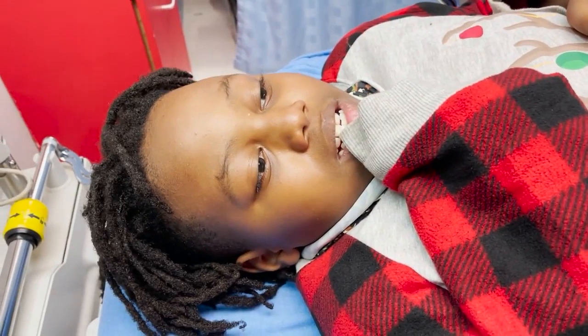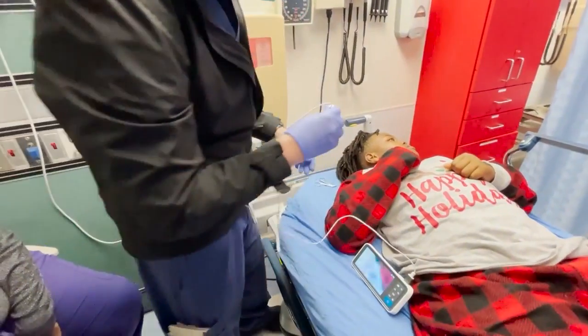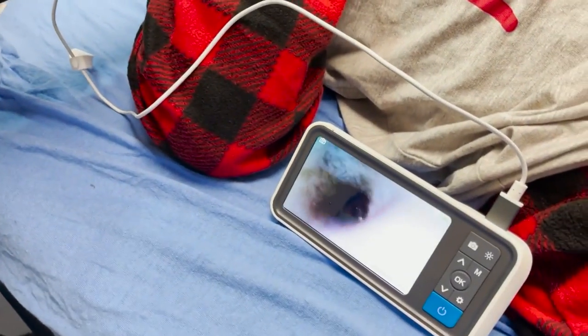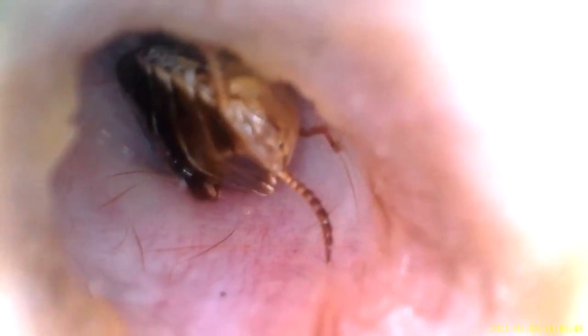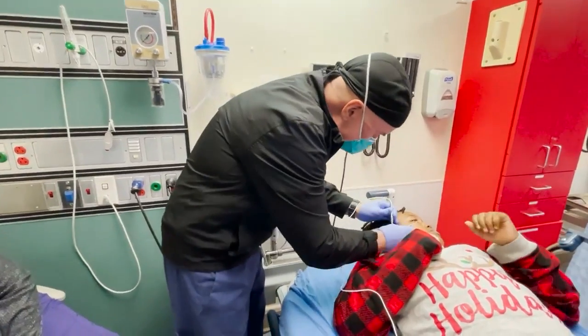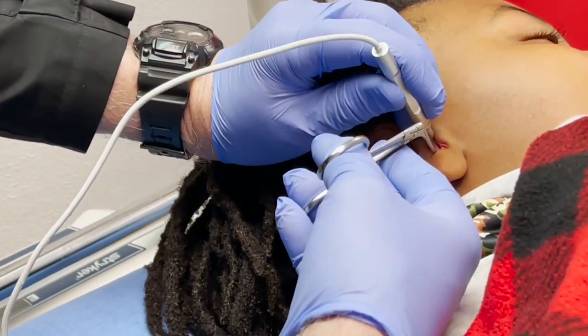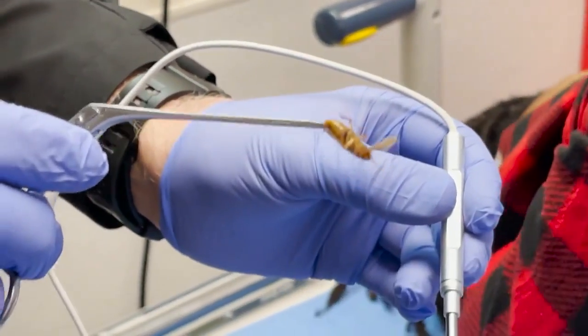He's got a little cockroach in there and we're going to demonstrate hopefully just one way of taking it out. Can you see that? Now the question is, is he moving? So I'm going to start by putting this in here. We got it. It's the culprit. There he is.